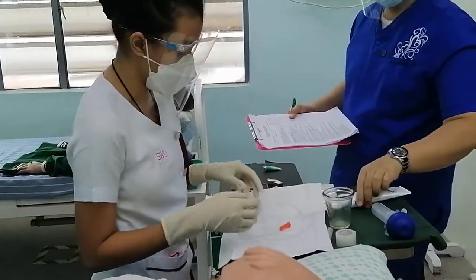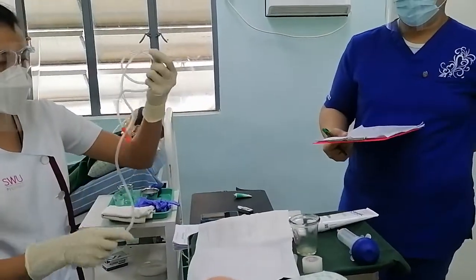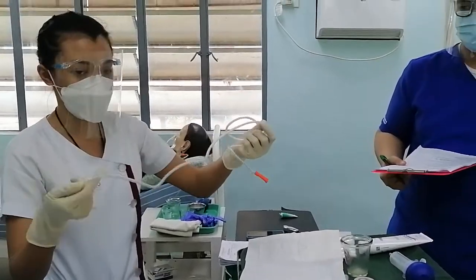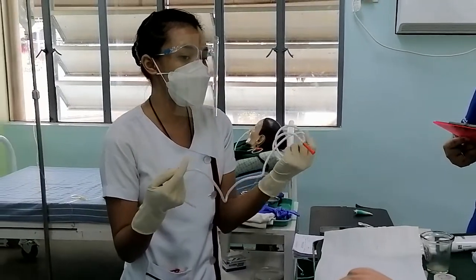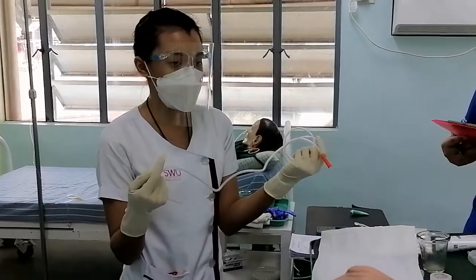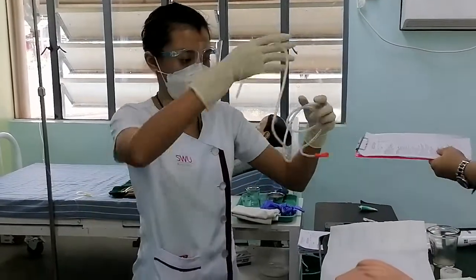And then I will measure the NGT tube from the nostril of the patient to the earlobe and then to the xiphoid process. The purpose of this is so that we will not underestimate or overestimate the length, because if we do that, probably the position of the tube will be at the wrong organ.